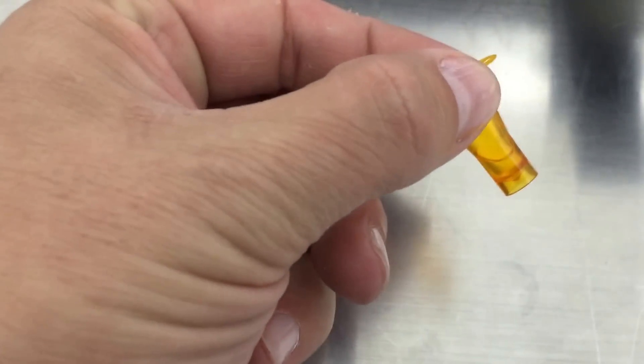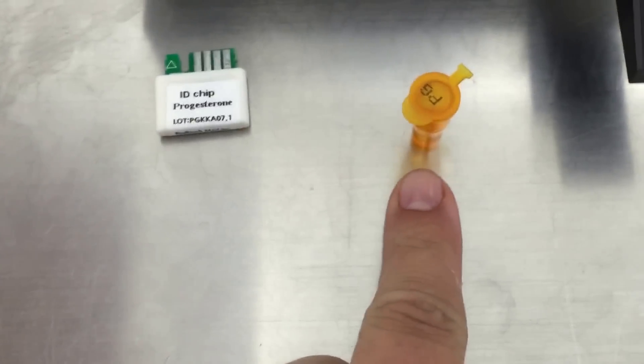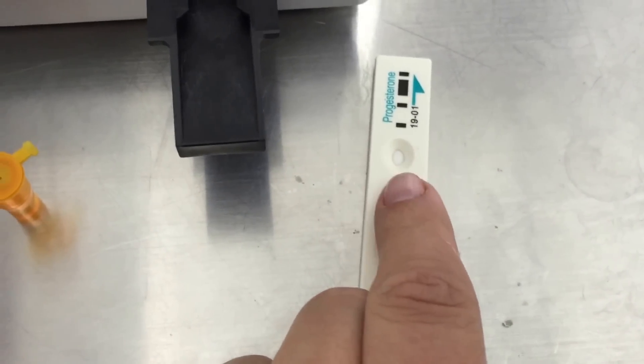This is the buffer. You mix it 10 times. After it's mixed, you want to withdraw 75 µL from here and put it in here.